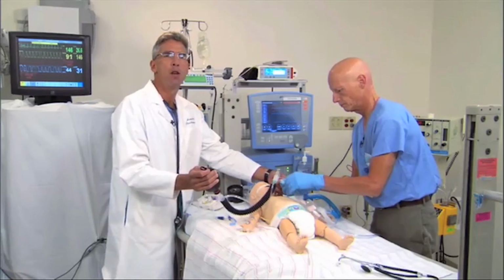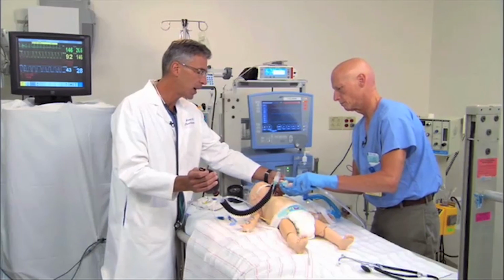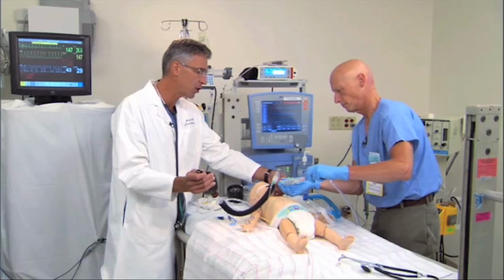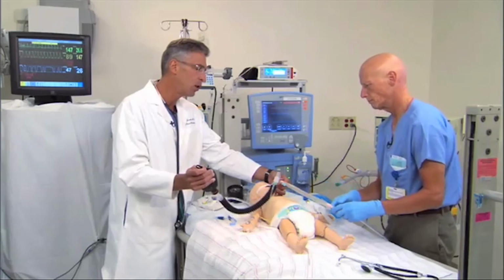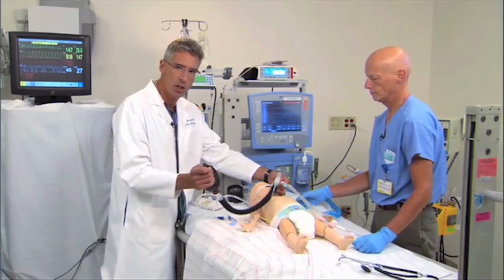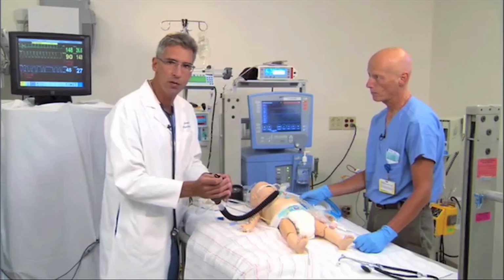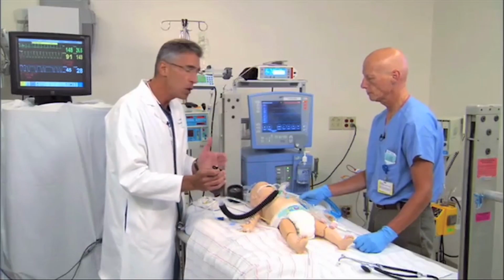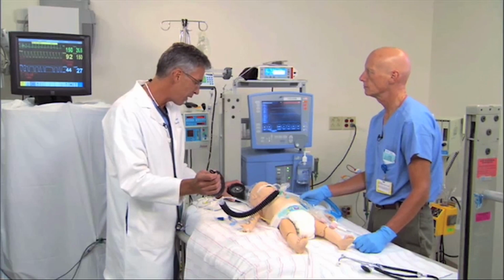Realize that in patients with small endotracheal tubes, the size of that catheter may in fact increase expiratory resistance to the point where you can actually air trap. So be gentle as you manually inflate. Now notice that we've de-recruited the lung. Even with inline suctioning, you may have seen the pressure loss in the circuit. There's no way to remove secretions from the endotracheal tube without some de-recruitment. But we try to minimize that by not disconnecting the patient from the ventilator.